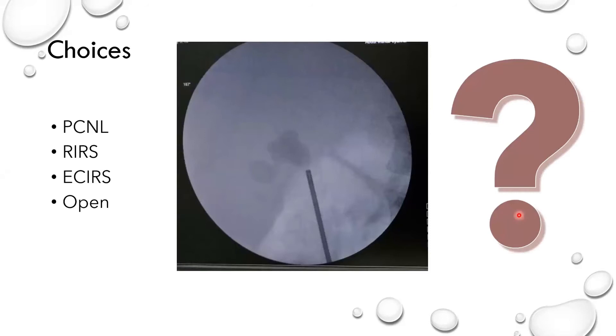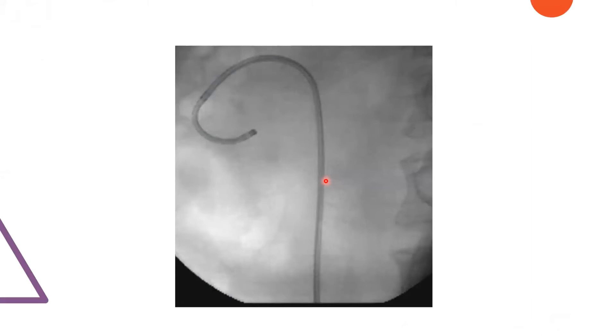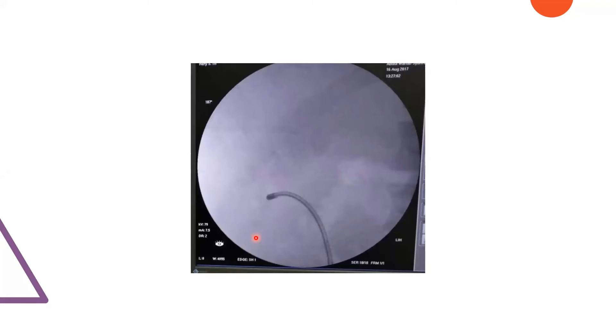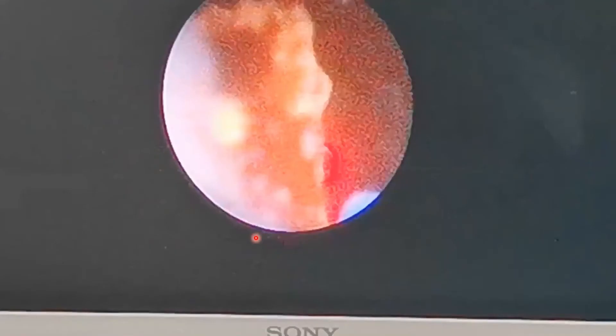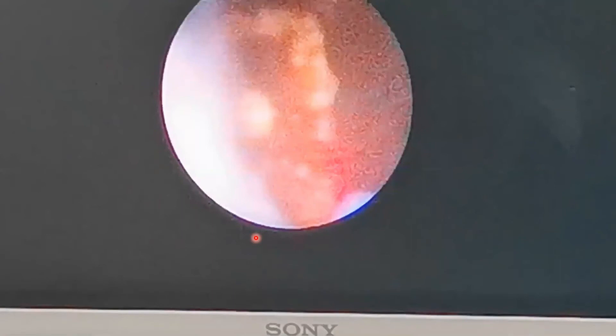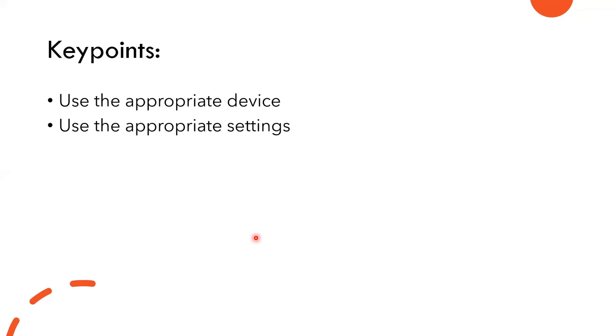In my hospital we have four urologists and we have a commitment that we don't do open surgery for stone unless it is a very complex stone. For this stone, I used retrograde intrarenal surgery with the flexible ureteroscope, and I remember doing this for about one and a half hours. The key points are: use the appropriate device, use the appropriate settings, and use the ureteral access sheath for big stones like this.